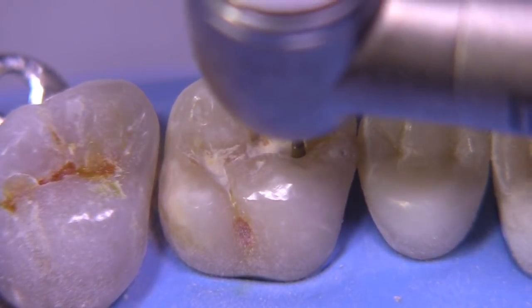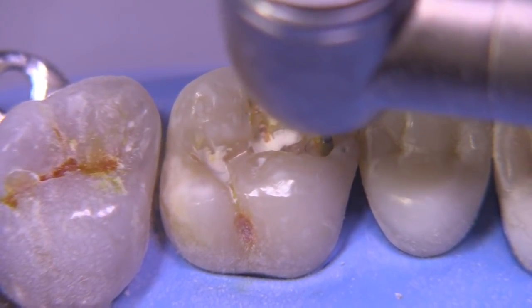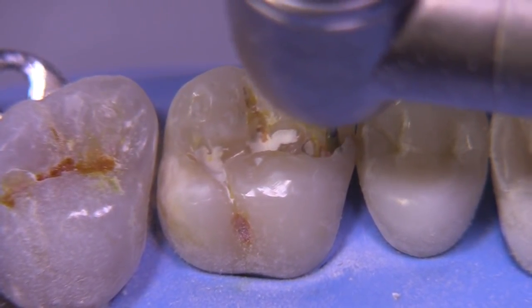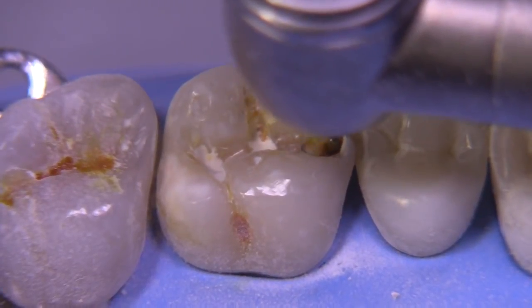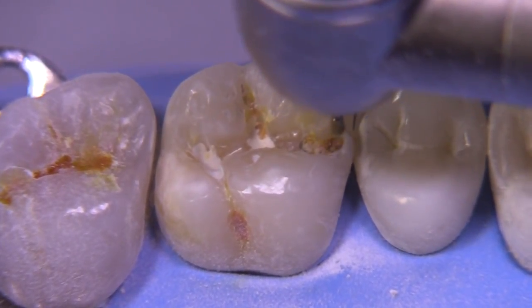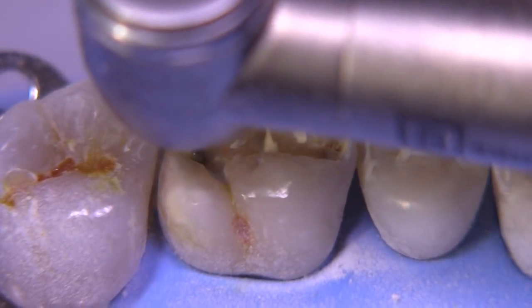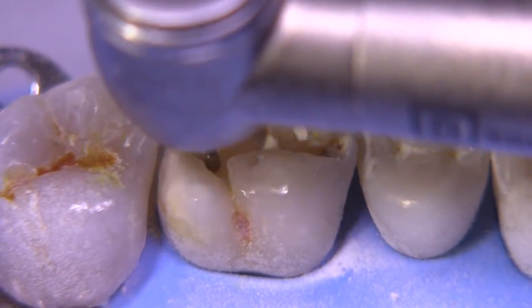Now here on the mesial, there's a lot of caries that I had placed in there and it's just sort of falling apart on us. It can be a little bit unnerving when this happens when you're working clinically, but just try to stick to the outline form as conservative as you can. Sometimes the walls are very soft and crumbly and they'll widen almost without pushing the burr at all — that's just the way it goes in the clinical world.